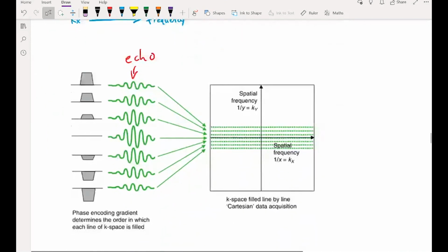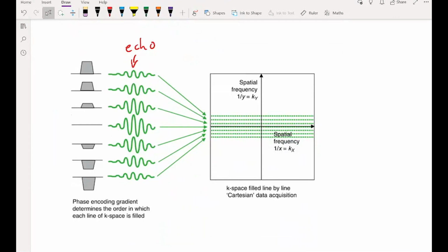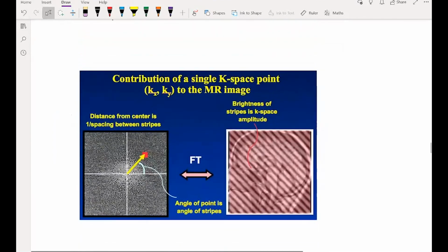Although you can see back down on this second diagram that when we have a greater amount of phase differences incurred by a stronger phase encoding gradient, we lose that signal fairly quickly and our echo becomes smaller in amplitude overall. And that's why the outsides of K-space are darker. But again, that might be too much nuance. Probably could have skipped that part.